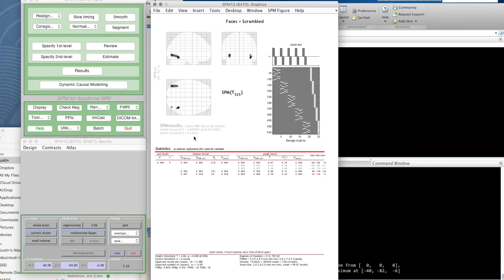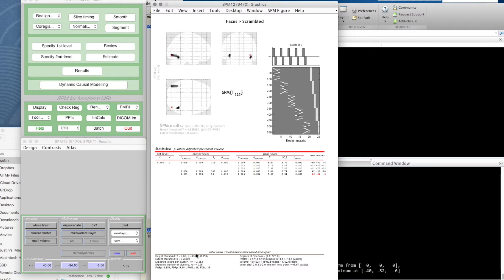We've got a little summary table here which I'll come back to. It says here the table shows three local maxima more than eight millimeters apart. We've got a little summary here—again, it repeats what the height threshold is.